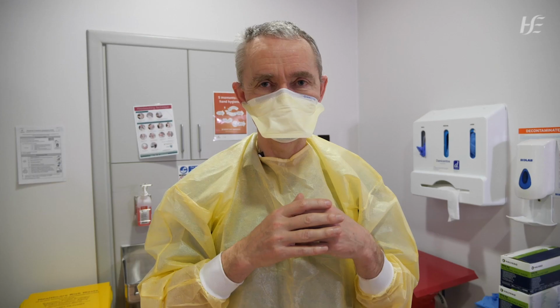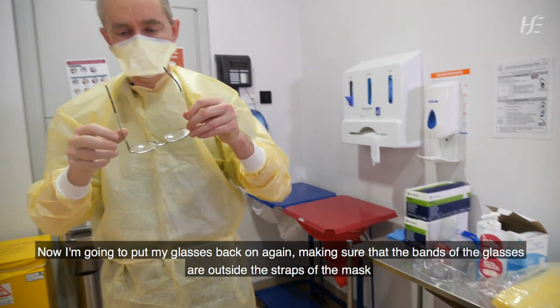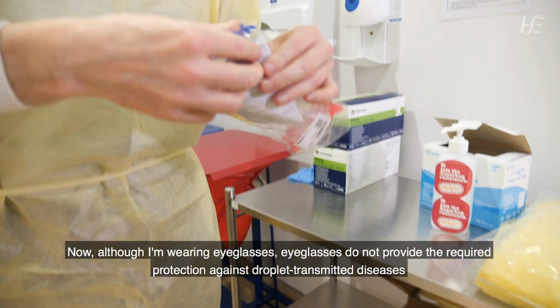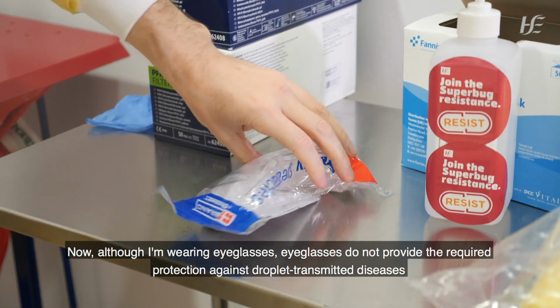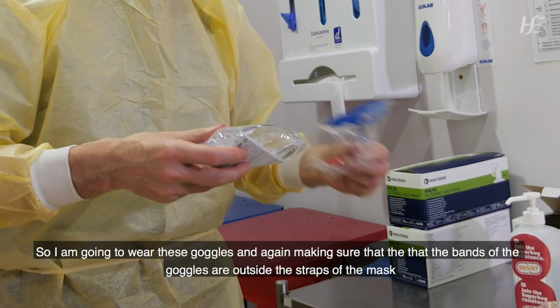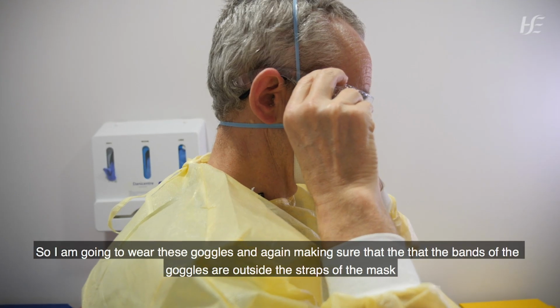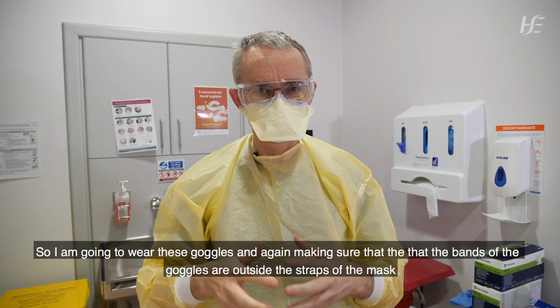And now I'm going to put my glasses back on, again making sure that the bands of the glasses are outside the straps of the mask. Although I'm wearing eyeglasses, they do not provide the required protection against droplet transmitted diseases. So I am going to wear these goggles, and again making sure that the bands of the goggles are outside the straps of the mask.